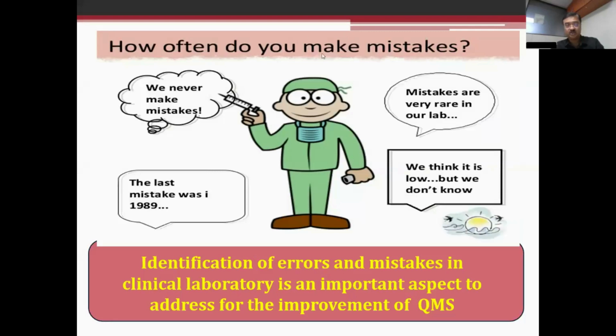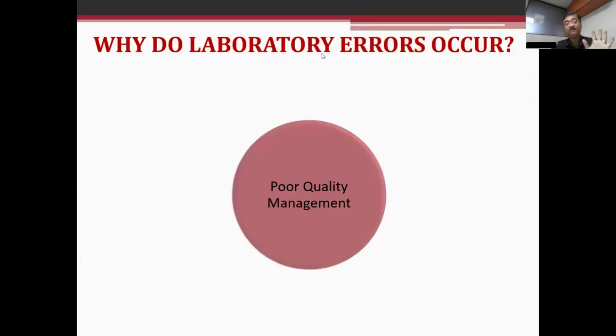Nobody can quantify his or her own mistakes unless a definite incident happens or a proper quality management system is in place to identify the errors and correct them.